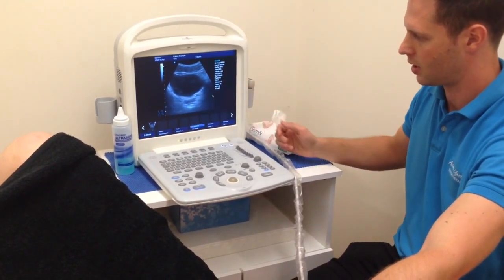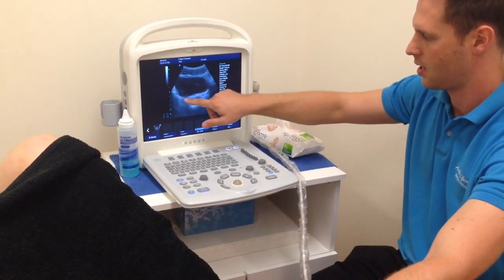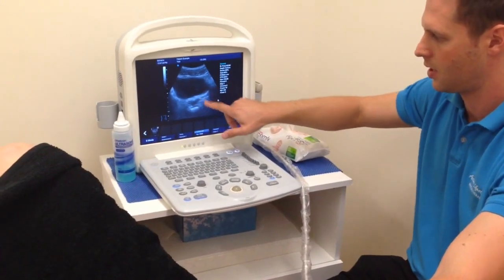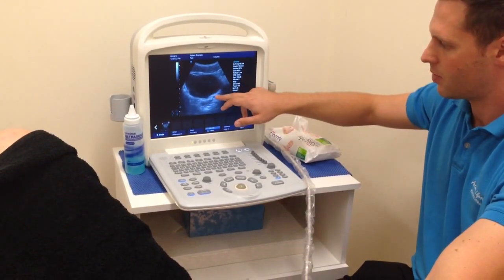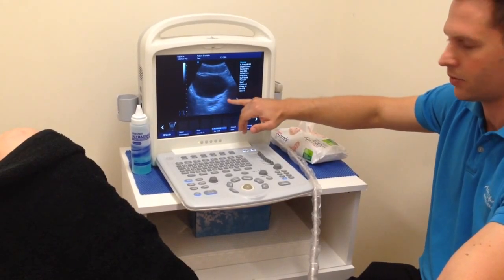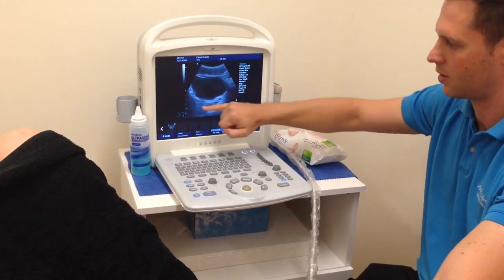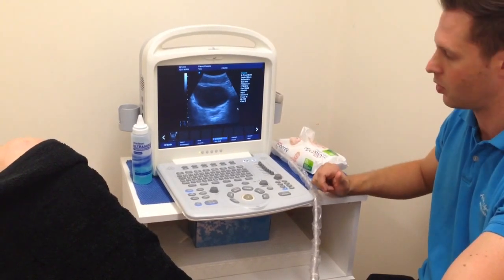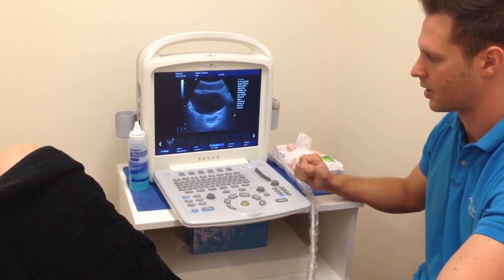Now I'll get you to do an active contraction of your pelvic floor. Perfect — hold it there. You can see that inferior posterior wall of the bladder rise up there, and he's able to hold that really well. Good strength. Something to keep in mind with this type of image: if somebody is very active already in their pelvic floor muscles and we're asking them to do a contraction, we may not see much of a lift because the wall of the bladder is already quite high due to hypertonic pelvic floor muscles — this can be incorrectly interpreted as weakness.